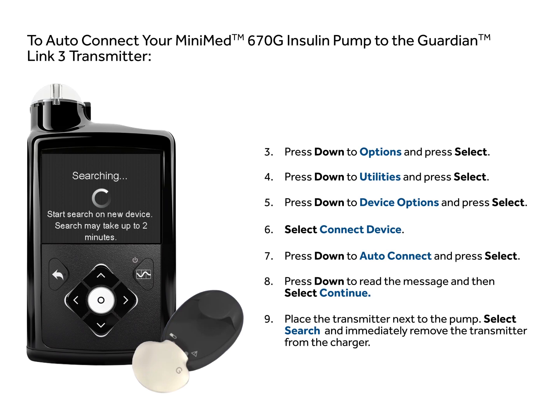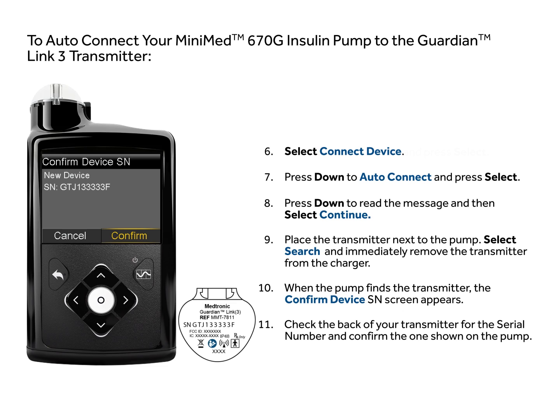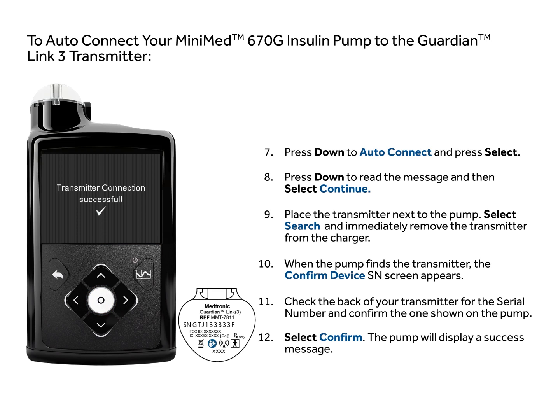The pump will search for the transmitter. When the pump finds the transmitter, the Confirm Device SN screen appears. Check the back of your Guardian Link 3 transmitter for the serial number and confirm the serial number matches the one shown on the pump. Select Confirm. The pump will display a Success message.